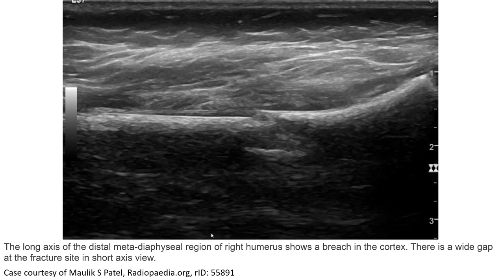This is an ultrasound image. In the long axis of the distal humeral metaphysis, this image of the right humerus shows a breach in the cortex. This is a wide gap at the fracture site seen in the short axis view.